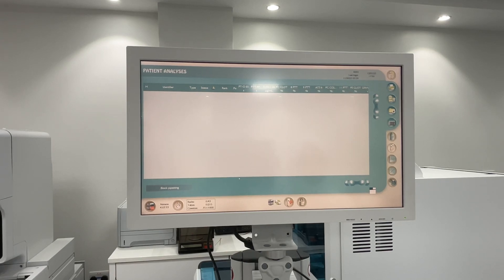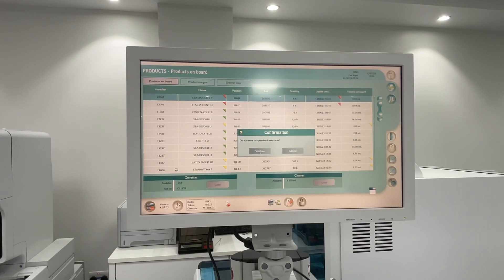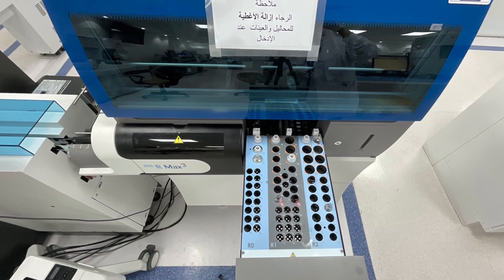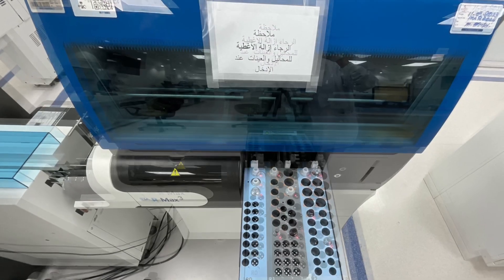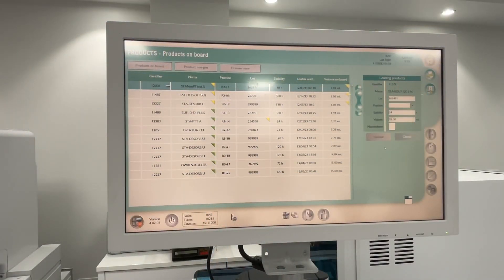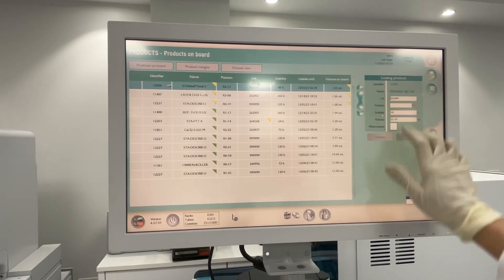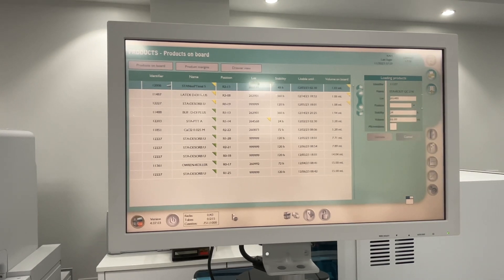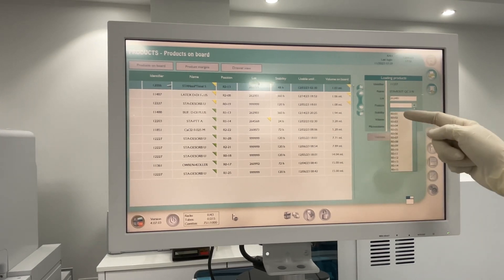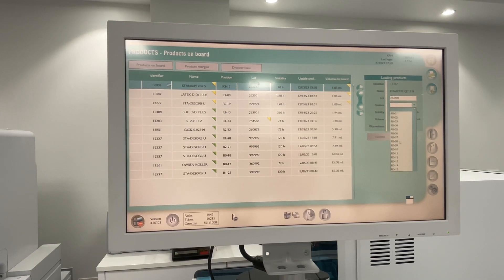To install a reagent and start, click the reagent icon, then Open, then Validate. If you are not sure where to put your reagent, click here and look at Loading Products. You will see positions - click on the drop-down menu and choose from the positions.